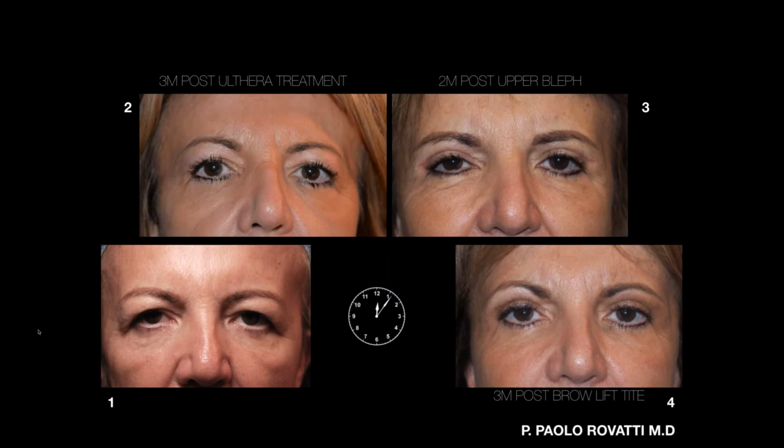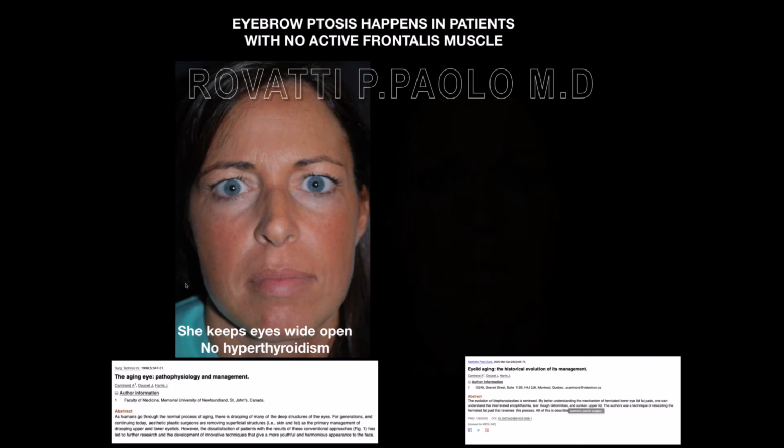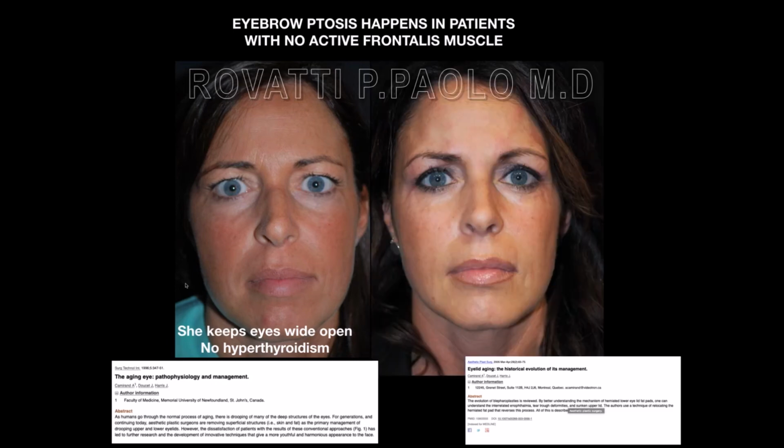This patient is just to show you that sometimes ptosis of the eyebrow happens in patients who have no active frontalis muscles. This patient had a long history of frontalis muscle treatment with botulinum toxin. And so every time toxin, all the time the frontalis muscle is not active. So she needs to keep her eyes wide open. She has no hyperthyroidism. It's only because she is using the frontalis muscles and is making a surprise face. After the treatment, we managed the brow lift, we did the brow, and we also got a good result about the face, and not the surprise face.